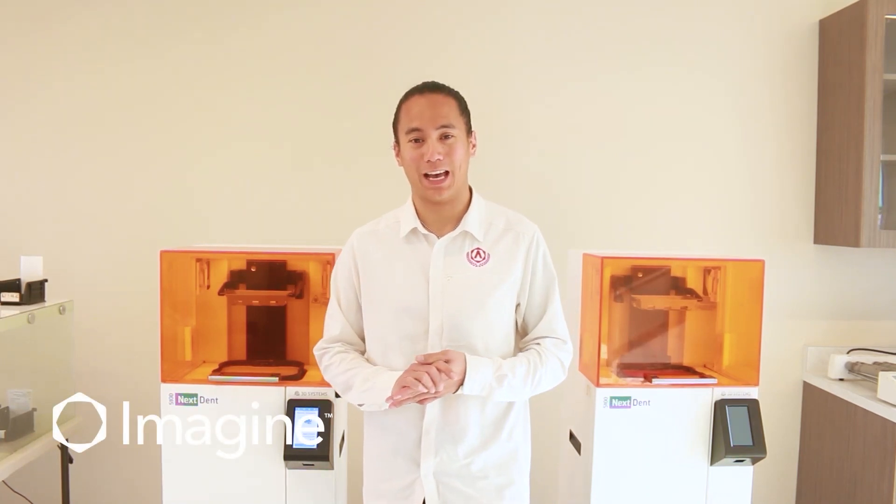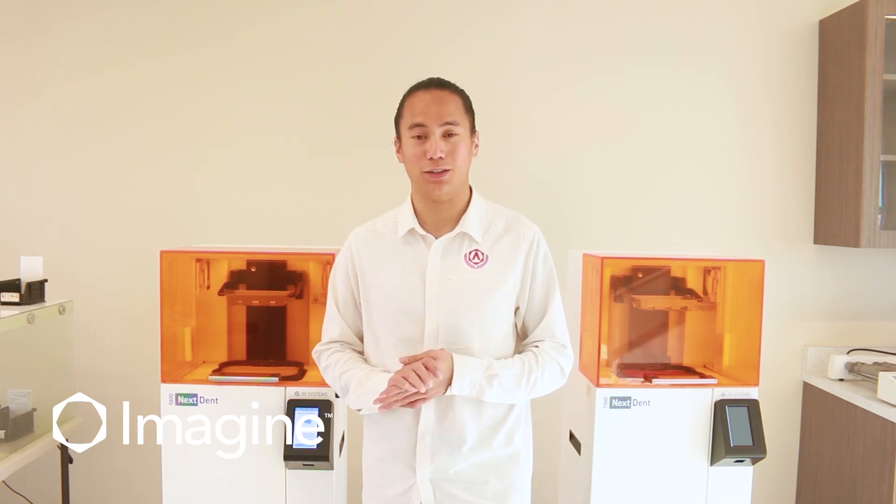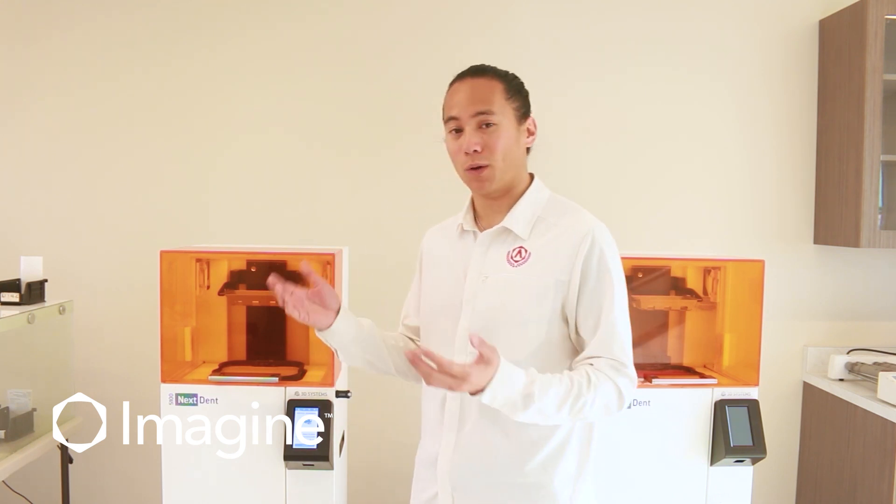Hi everyone, Andy here from Imagine Academy. Today we're going to be going over printing your models after everything has been nested in 3D Sprint. Once your files have been sent over from your computer to your printers, we'll start the printing process.